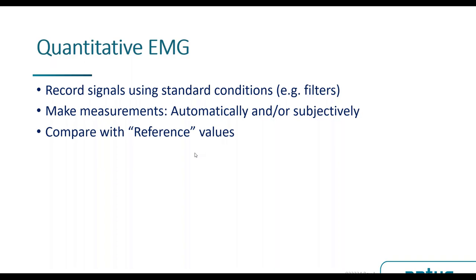Note that I'm not using the term normal values, because when we say normal values, it is based upon a few so-called presumed healthy subjects that we examine and come up with data. We like to use the term reference because these are general guidelines that we like to use in our assessment.